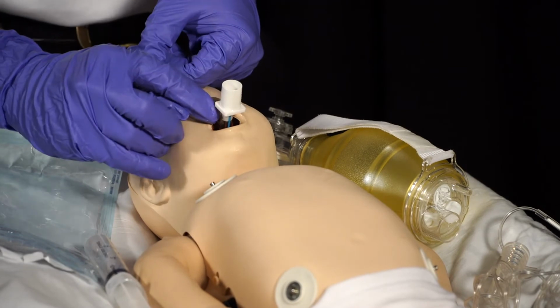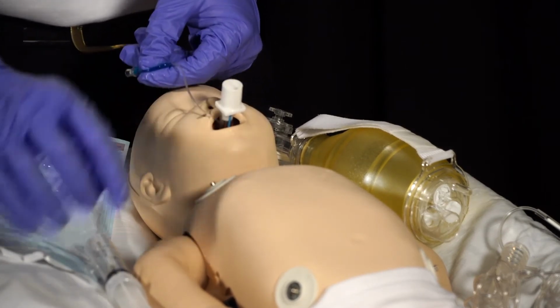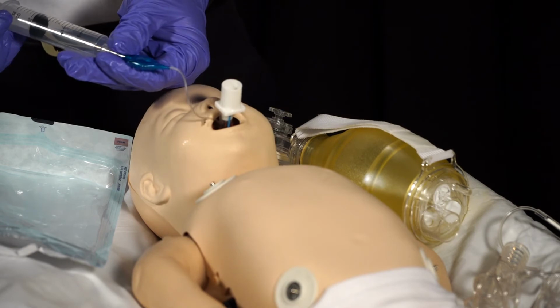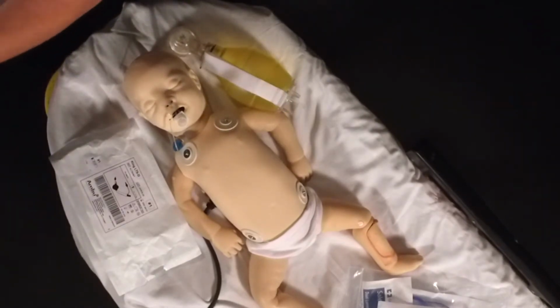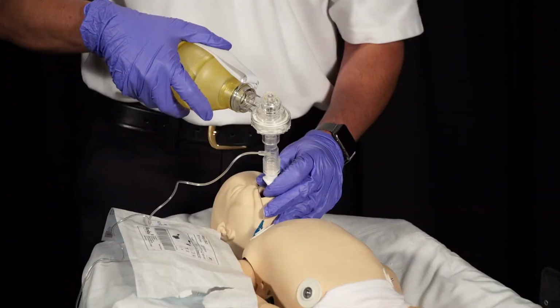You're trying to get the gastric access lumen, the back part where you insert the gastric tube, all the way down to the teeth. After you do that, you're going to rotate it back to midline like I did, and then inflate it to the desired amount. The next portion is we're going to use our inline filter, tidal CO2 inline filter. So now we're going to use our BVM.